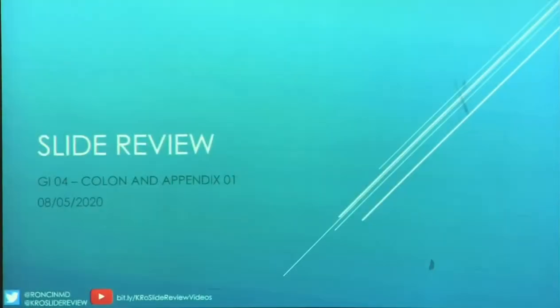Welcome to Slide Review. So today we are going to finish off our GI chapter going into some of the malignant colon and appendiceal lesions.